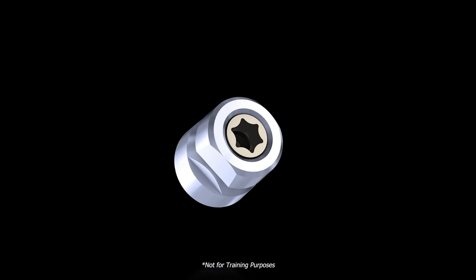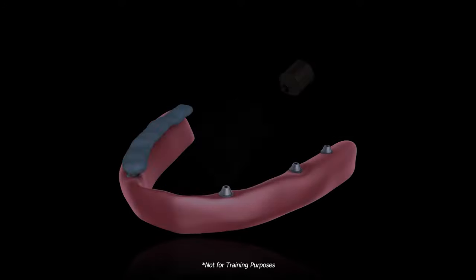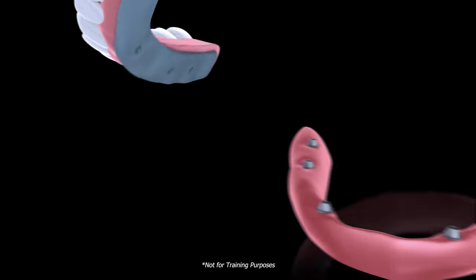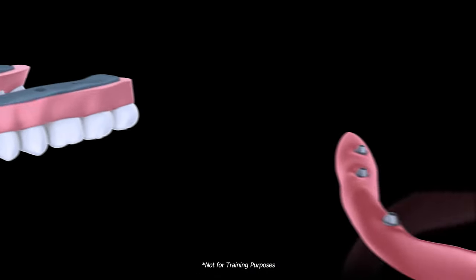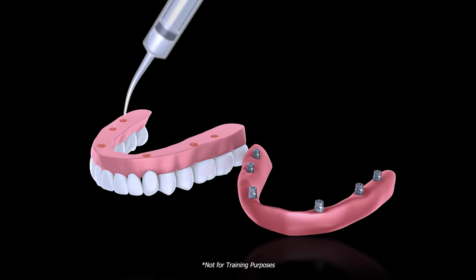At the heart of the solution is our simplified separable fastener. Here's how much better this works. Test seat the prosthetic to determine where to create wells for the tie bases. Then secure the tie base insert with our separable fasteners using a torque driver that ensures you don't over-tighten.